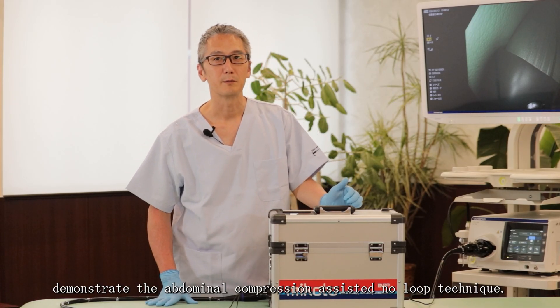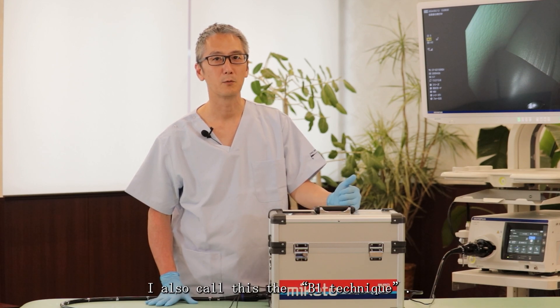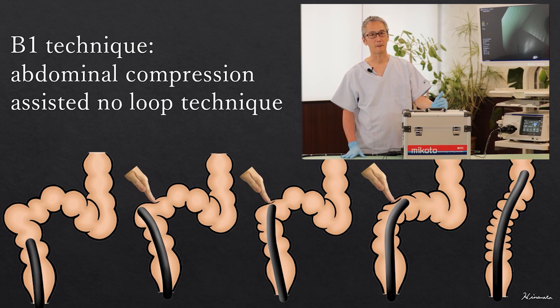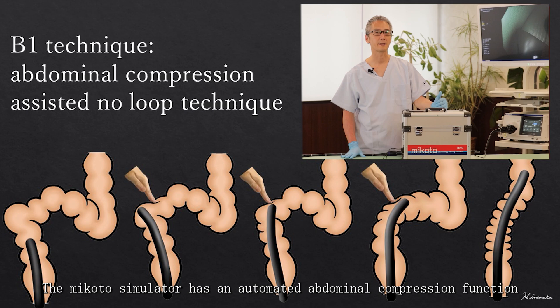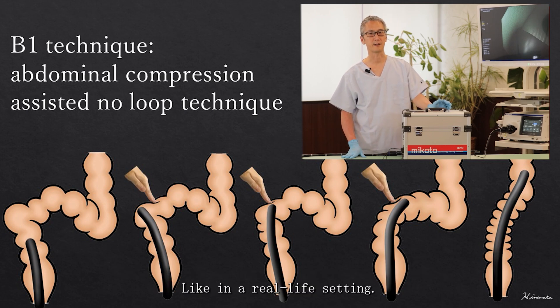I will demonstrate the abdominal compression assisted no loop technique, which I also call the B1 technique. This technique avoids sigmoid stretching with the help of abdominal compression. The Mikoto simulator has an automated abdominal compression function that can help you pass through the sigmoid colon without stretching it, like in a real-life setting.